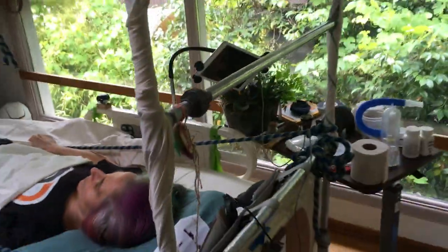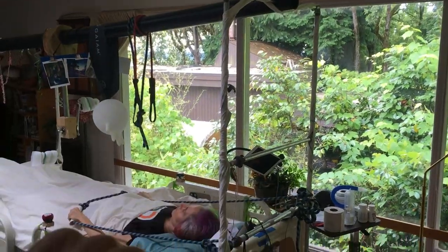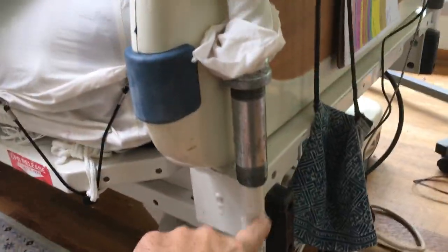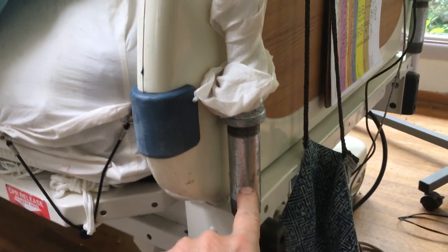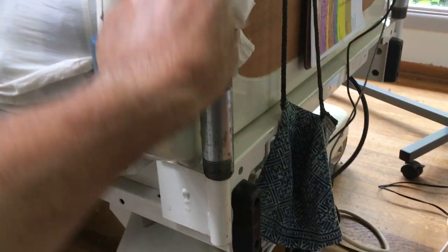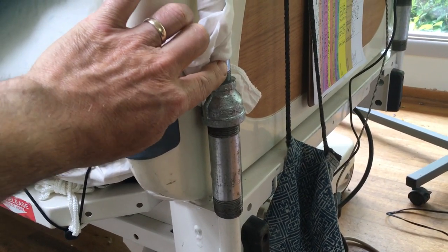Here we have three crossbars at the head of the bed — two, three — and these connect right to the steel posts that are part of the Stryker bed. It turns out that an inch-and-a-quarter diameter steel pipe fits exactly snugly over the standard pipe welded onto the Stryker frame, and then we simply use a reducer to go straight to the half-inch pipe size.